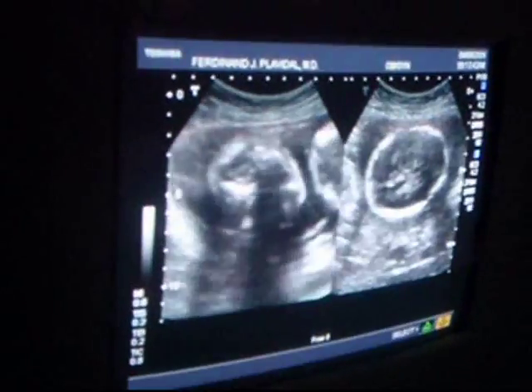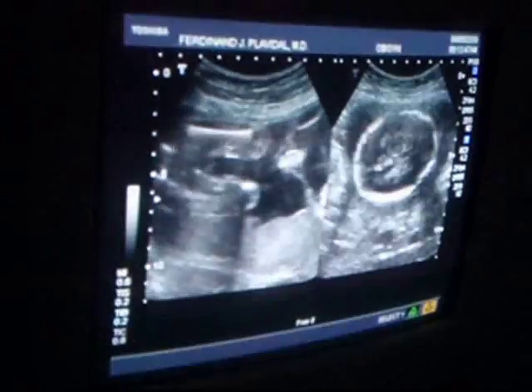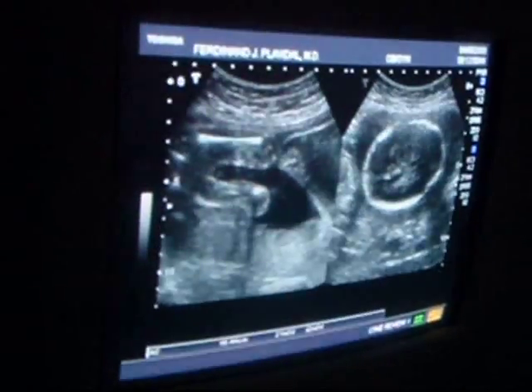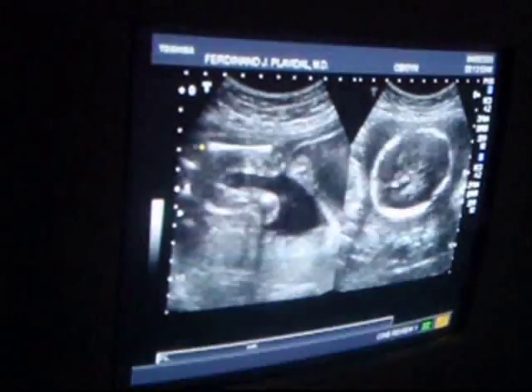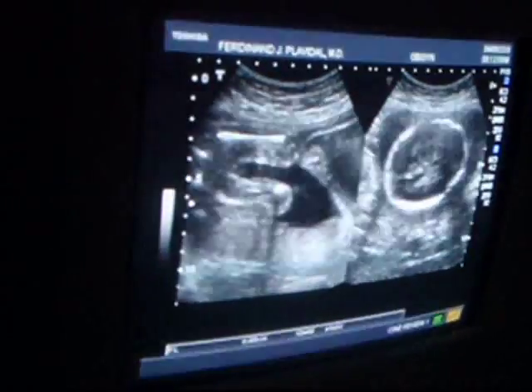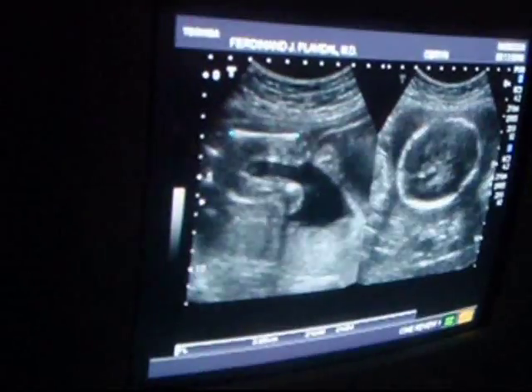We're going to go down and get this kiddo's thigh bones coming up this way here. There's our femur. Oh, thank you, pal. Right there. And we'll look at the next measurement, which is the femur measurement right here. We'll set that. Now the machine says this baby's 21 weeks and 6 days, estimates the due date the 14th of August, and says this kid weighs about 1 pound, 435 grams, give or take a little bit.